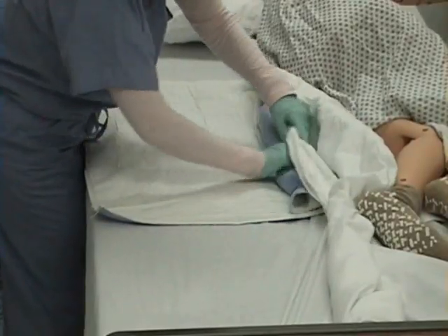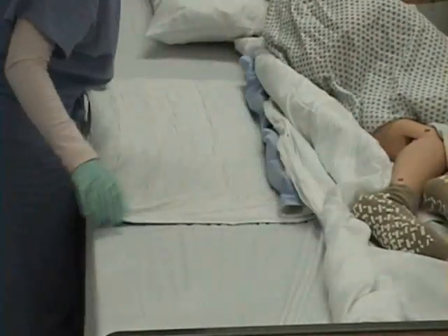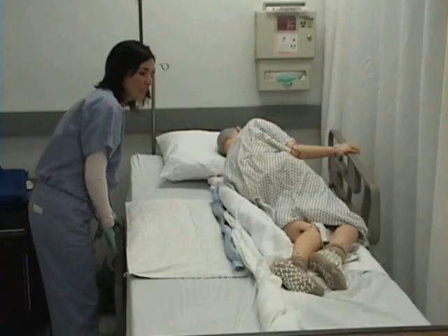I will tuck under my clean sheet. I want to make sure that I don't have wrinkles in my sheets. I will put the side rail up.